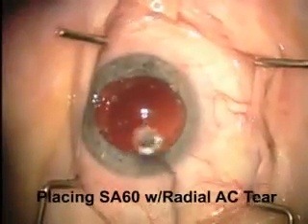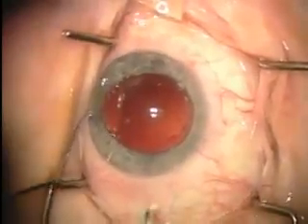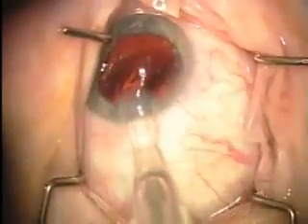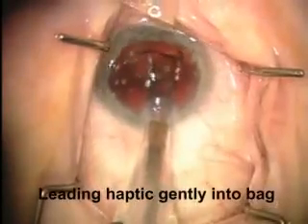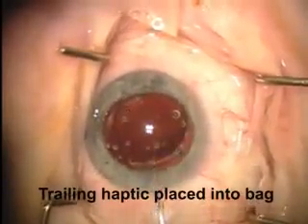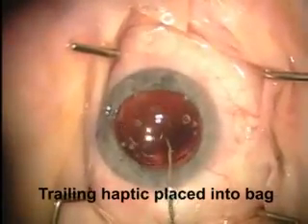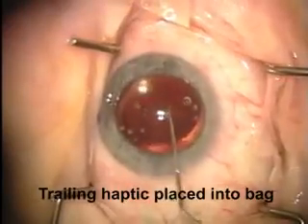Here's a situation which occurs fairly commonly — a radial tear in the anterior capsule. In this situation, I like to place a single-piece acrylic lens because I think it applies the least stress on the capsular bag and is least likely to go radial. Here is an SA-60 lens being placed very gently into the capsular bag. This is Dr. Beaver at our institution doing a beautiful job of being very careful to place the intraocular lens just into the bag. It's best not to rotate too much and to place the lens as gently as possible. It's nicely centered despite the tear and this lens will most likely be centered for life.